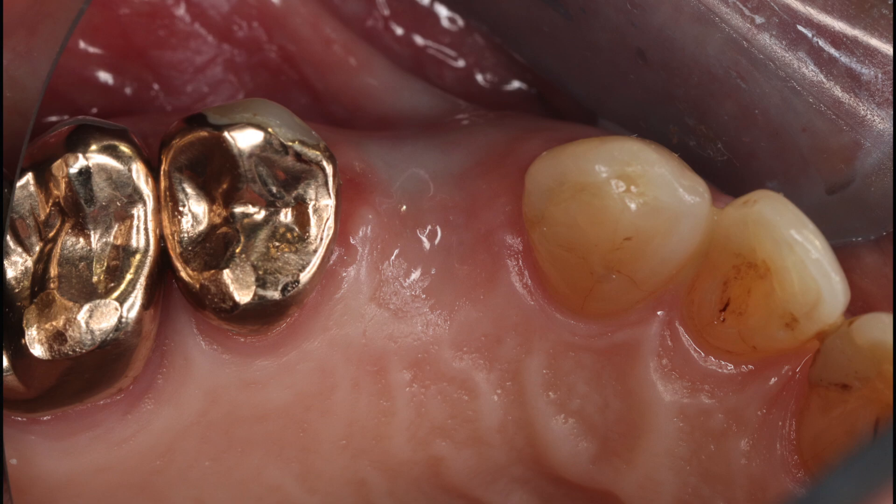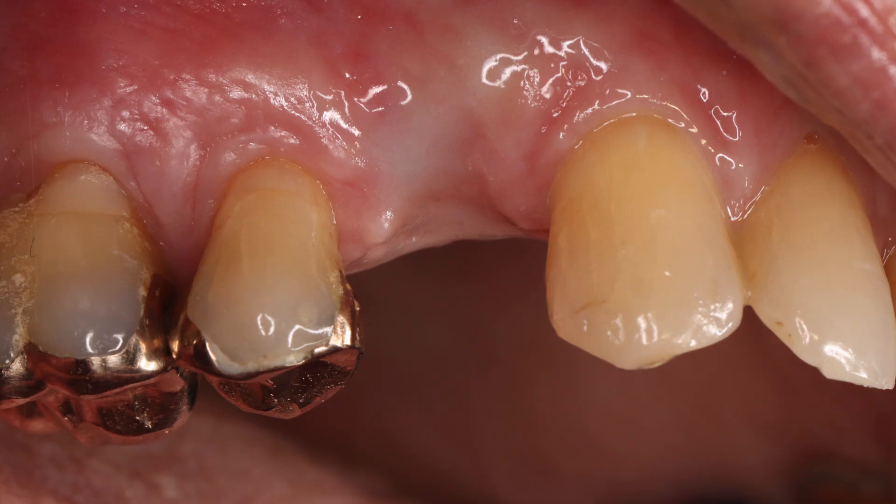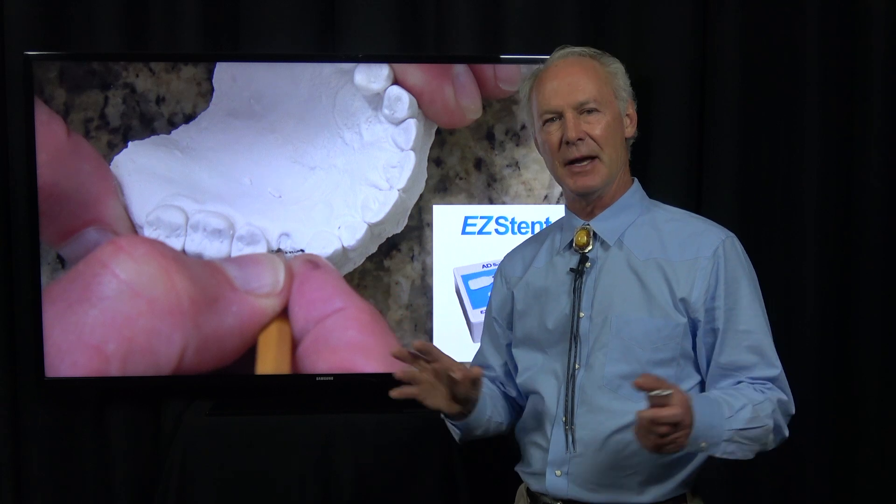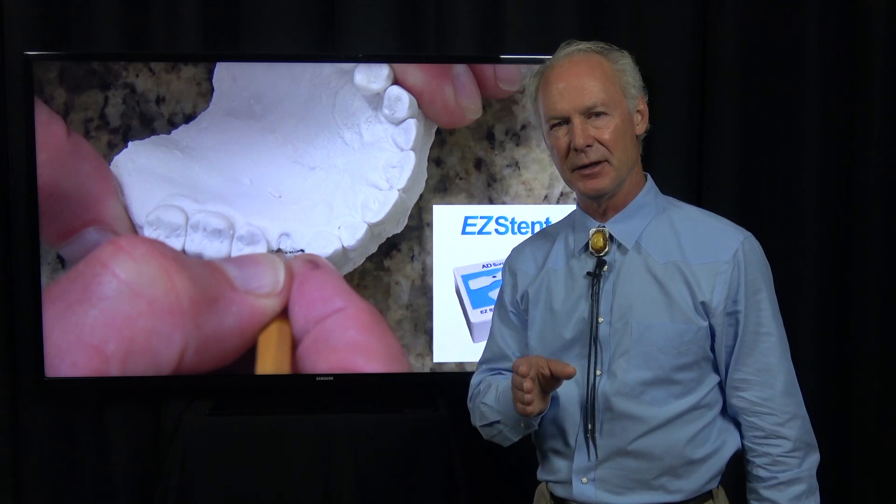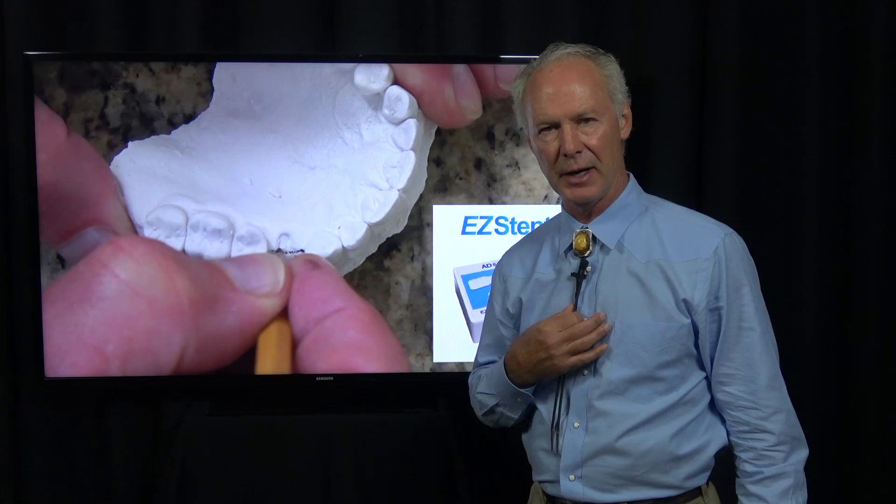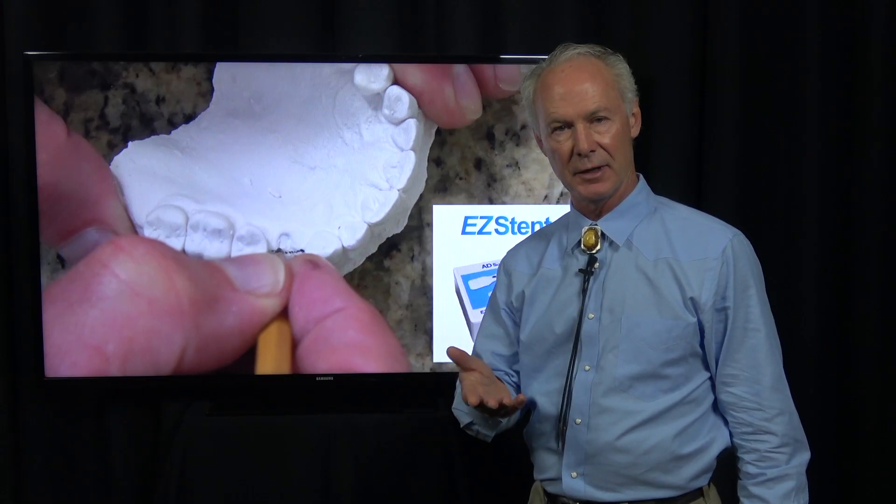I'm going to use the Easy Stent. If you aren't using this for implant placement, you're messing up. It's so easy and effective. I'm not going to tell you anything that's not the truth from practical experience. Remember, I practice four days a week just like you.